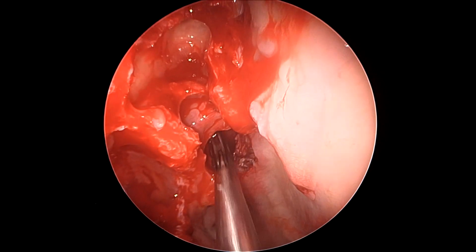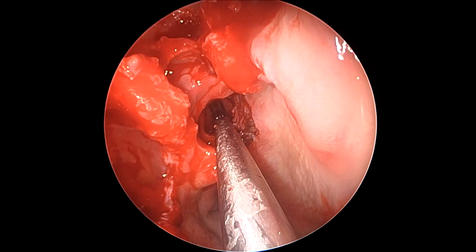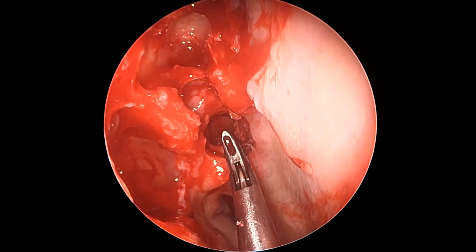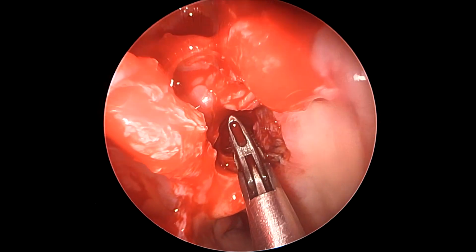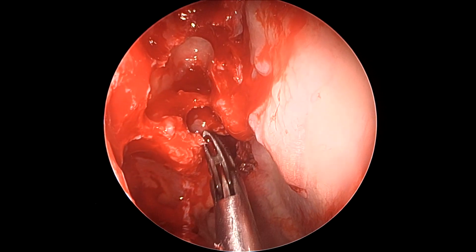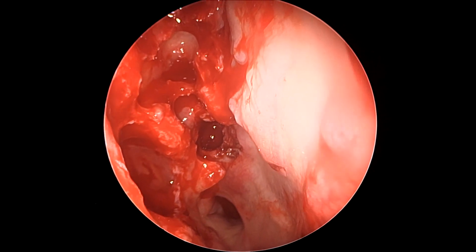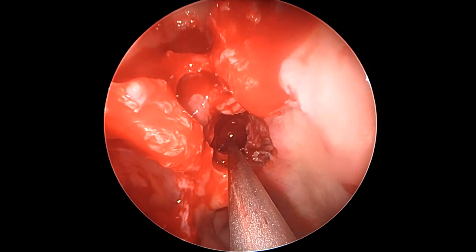Now we use a straight true-cut instrument to palpate the level of bone difference between the sphenoid and the ethmoid cavity, and we need to break septations. So we use a straight fine true cut, and we start removing the septation between the sphenoid and the posterior ethmoid cells. The advantage of this technique is that each time we can palpate the skull base before taking a punch or a bite of the bone.